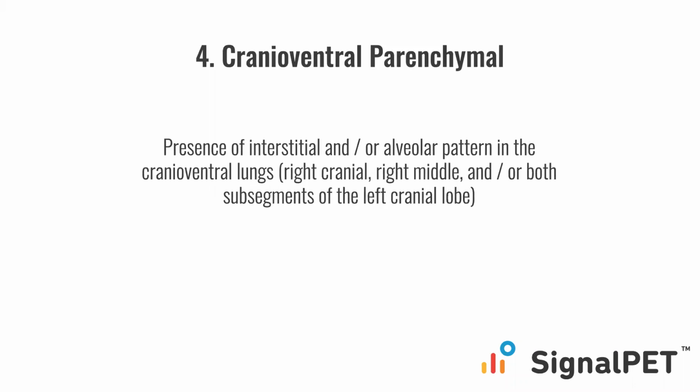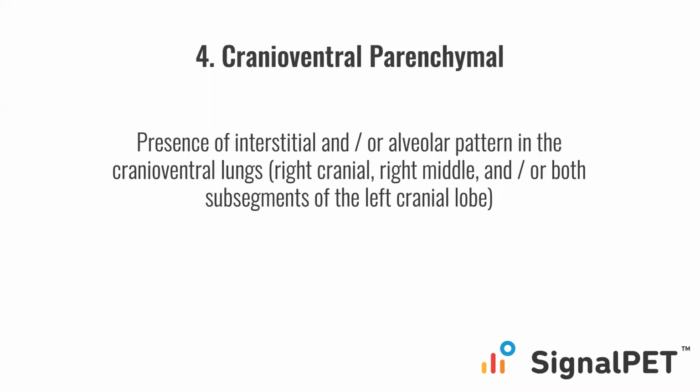So now we're going to be a little bit more specific. We discussed a pulmonary bronchointerstitial infiltrate. Again, the good news is it's good to have the background, but the test results are done for you. You don't have to determine this anymore on your own. So keep that in mind.